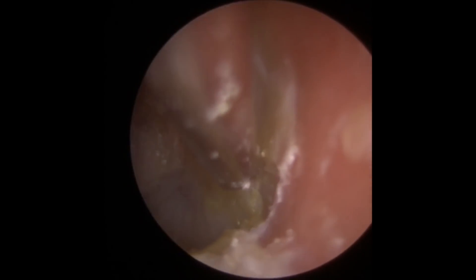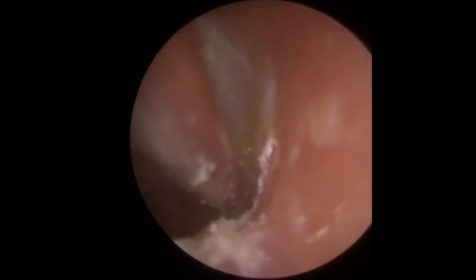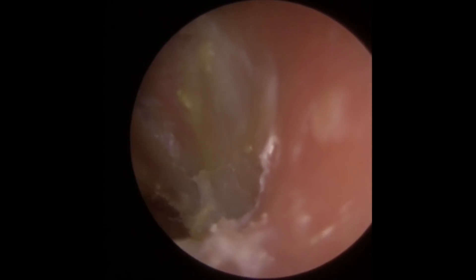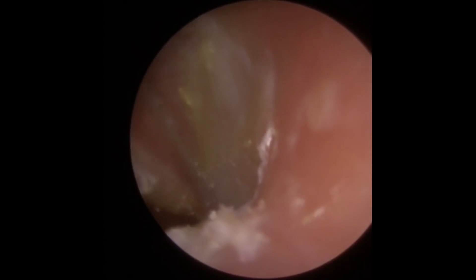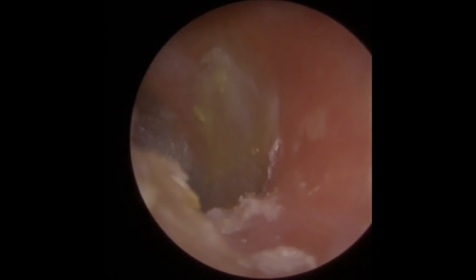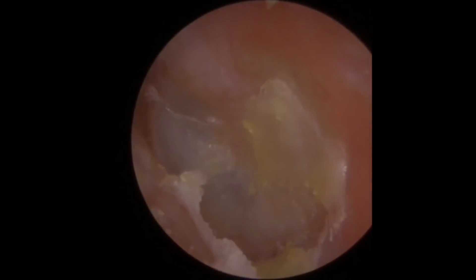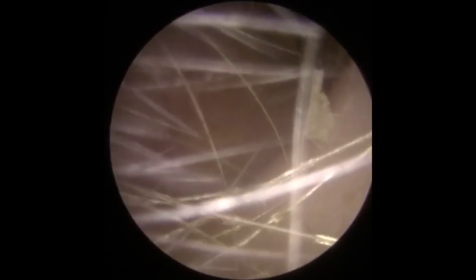You can see the tremor kicking in there again. I'm just taking away, trying to stay a couple of millimeters away from the drum. That's as much as I want to take away safely for this patient, really. It's difficult to clear the remainder — I'd have to be on top of the eardrum, and with that tremor I don't want to run the risk of perforating the eardrum.